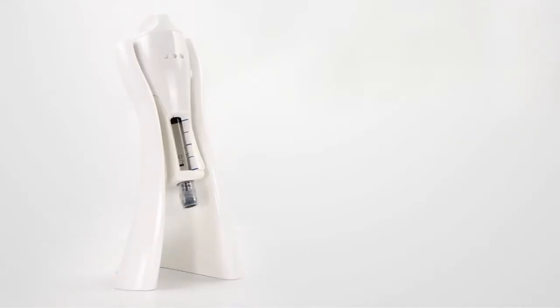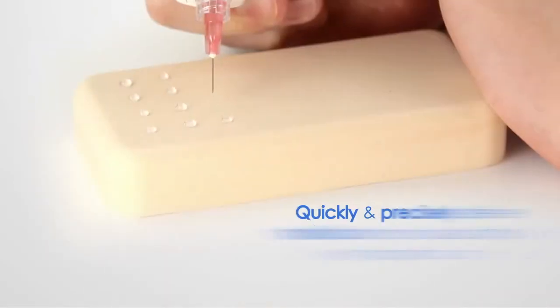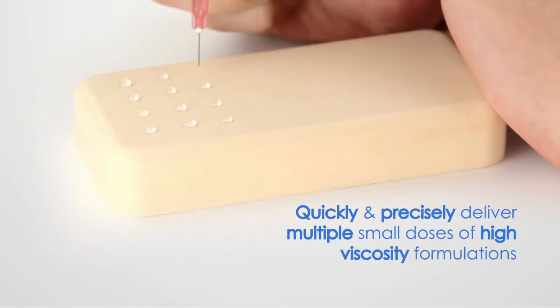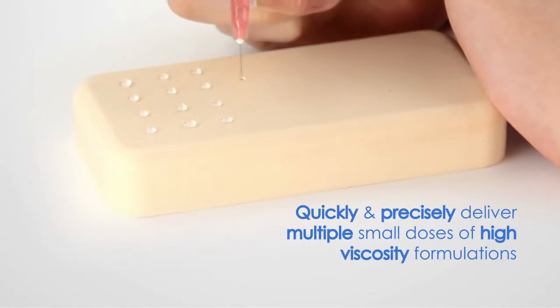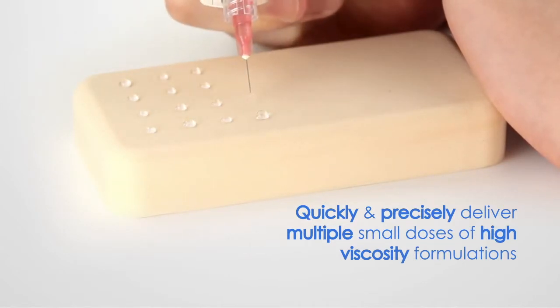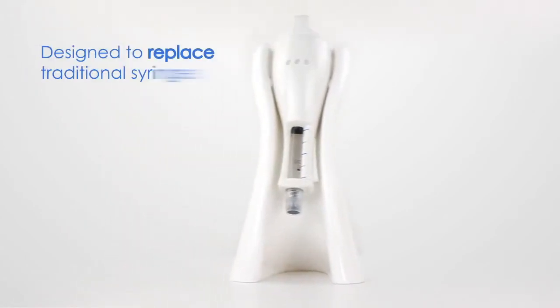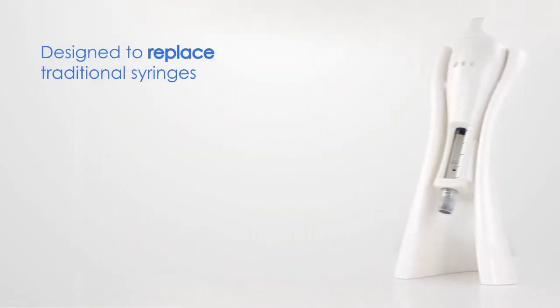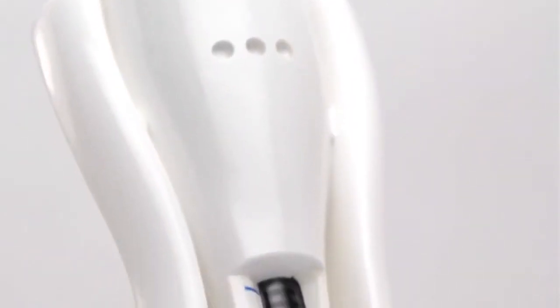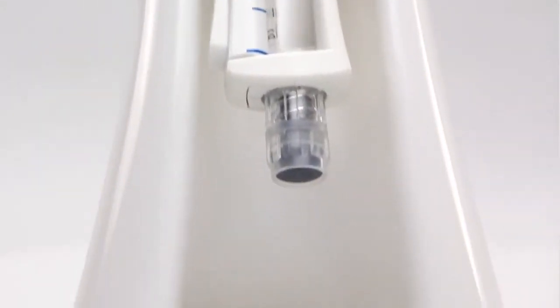The Precision Pen Injector, or PPI, developed by SHL Group, is a compact and easy-to-use device that enables the user to quickly and precisely deliver multiple small doses of highly viscous formulations. The PPI is designed to replace traditional syringes where desired accuracy may be difficult to achieve.